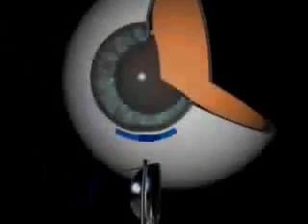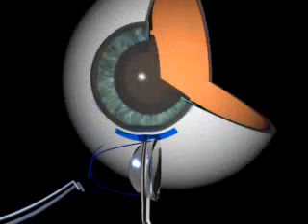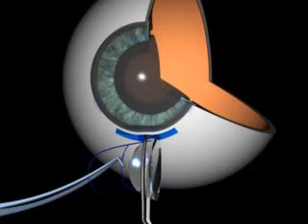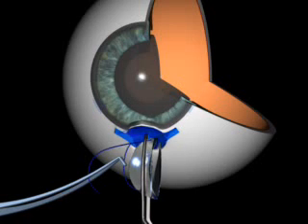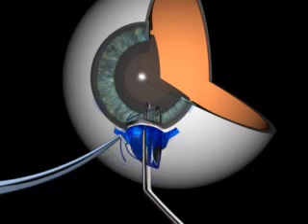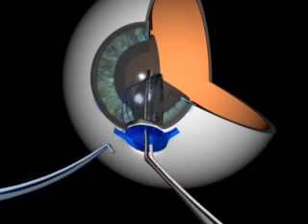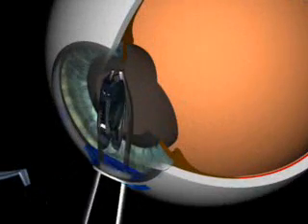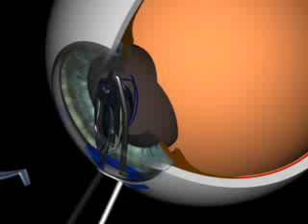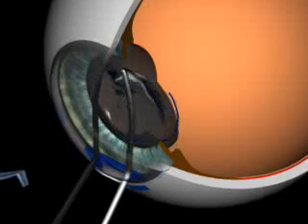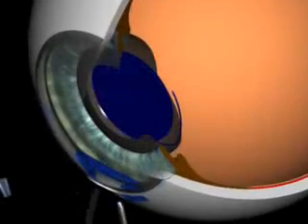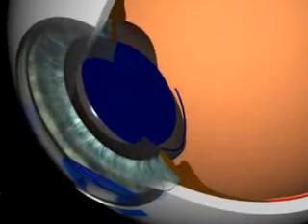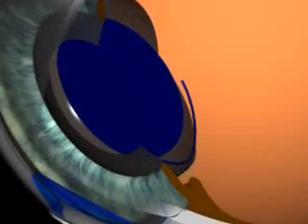IOL implantation. The folded IOL is inserted through the incision. The haptics of the IOL are positioned in the capsule bag and the lens is slowly unfolded. The optic of the IOL is also pushed into the bag.